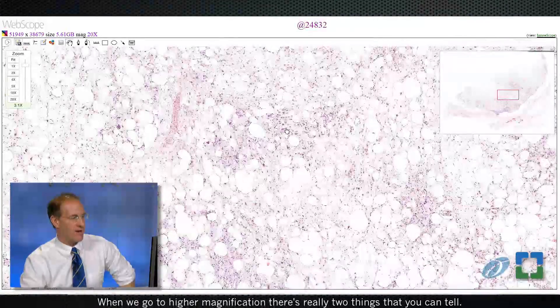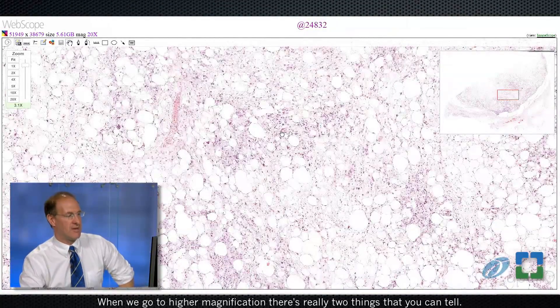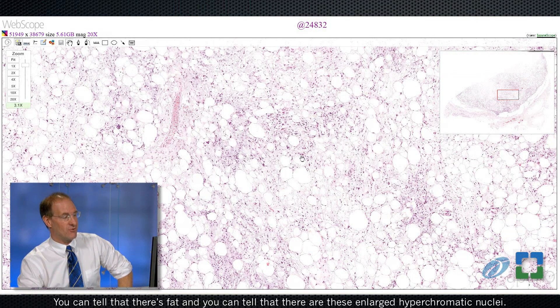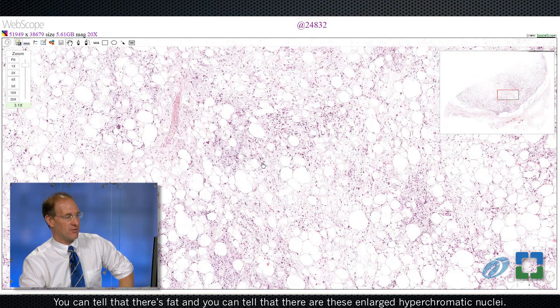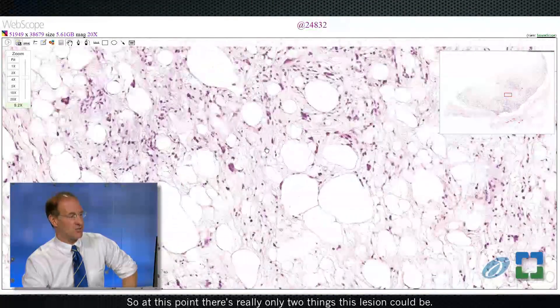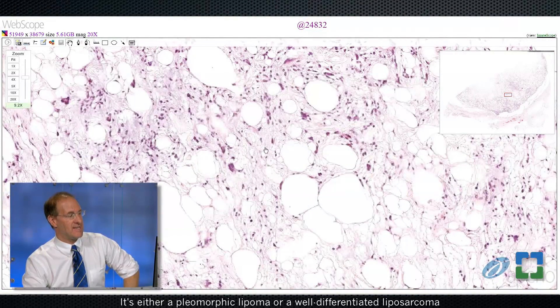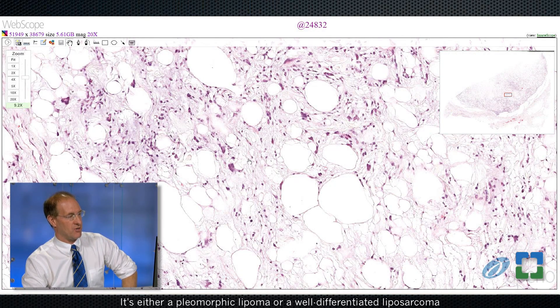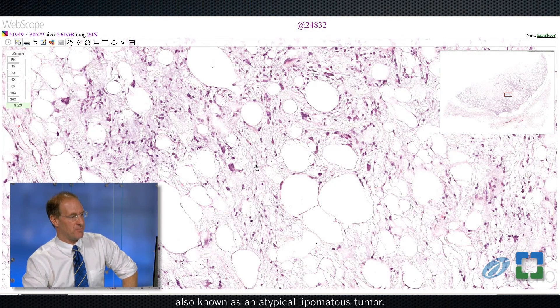When we go to higher magnification, there are really two things you can tell: there's fat, and there are these enlarged hyperchromatic nuclei. So at this point, there are really only two things this lesion could be — it's either a pleomorphic lipoma or a well-differentiated liposarcoma, also known as an atypical lipomatous tumor.